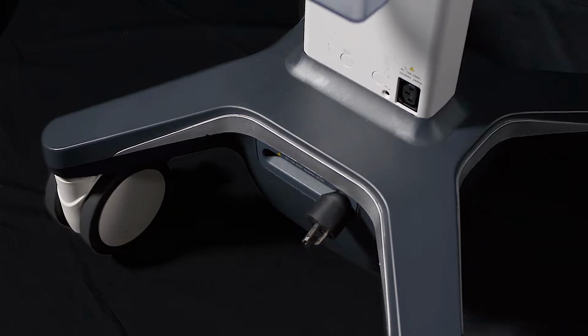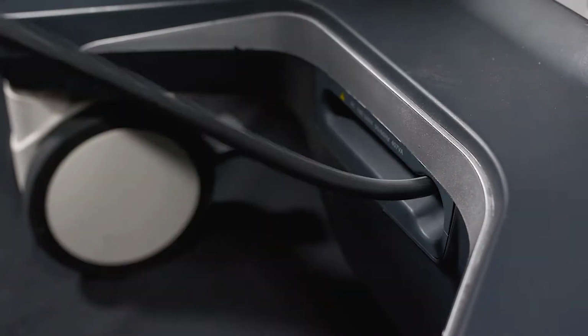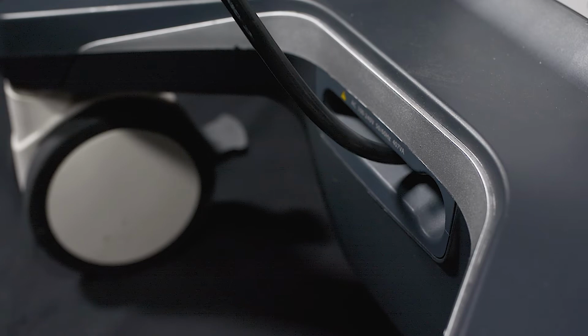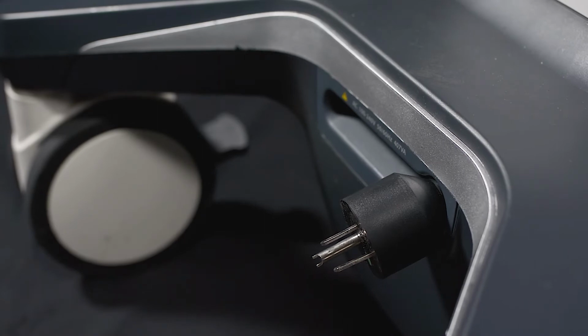The ME8 cart features a retractable power cable. Pull the power cord out to the side to lock the cord in place. To retract the power cord, pull it to the other side and the cord will retract on its own.